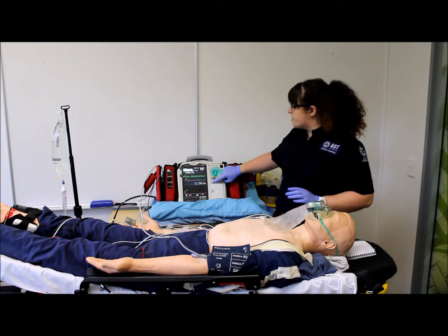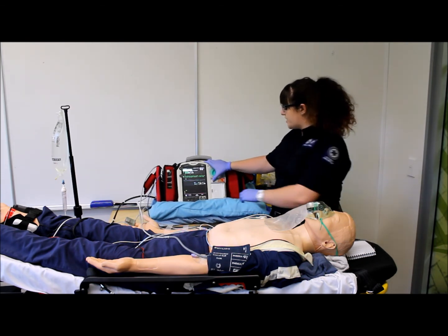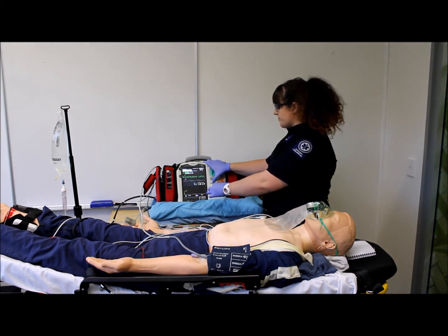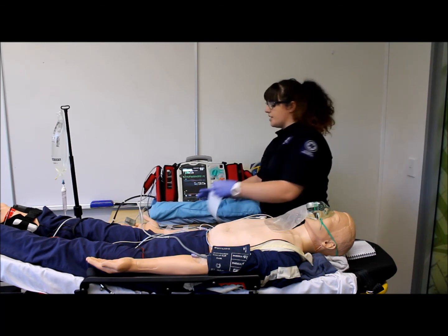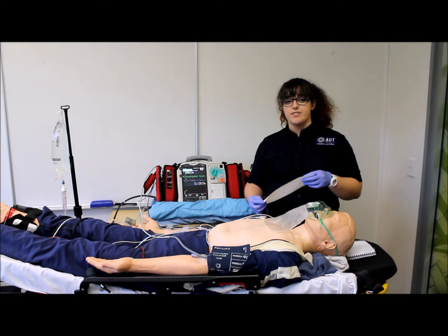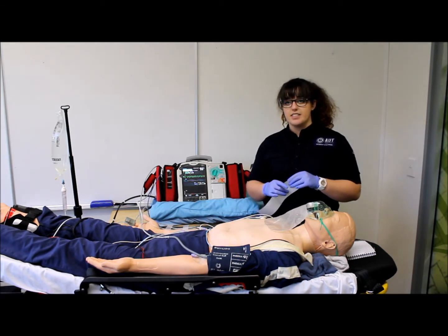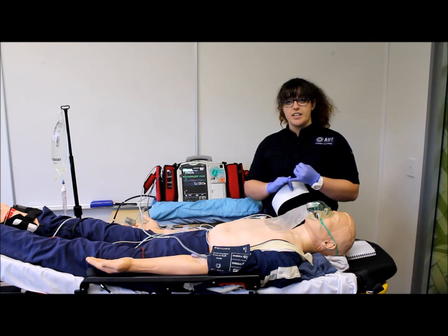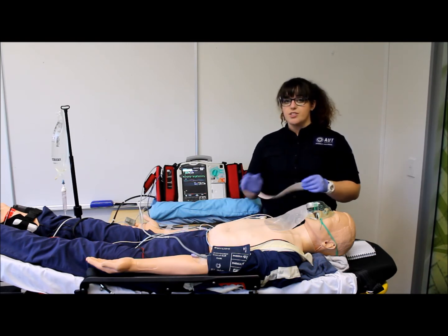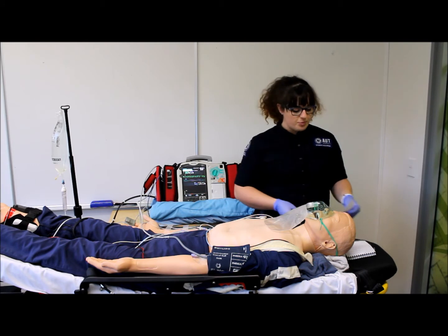First of all, I'm just going to print off our 12 lead to see what rhythm we are in. So this looks like he is in a VT. So our differentials for VT are electrolyte imbalances, which can be caused by kidney failure, potassium supplements, use of diuretics, and a recent MI, which is probably suspected here, and also SVT with aberrancy.